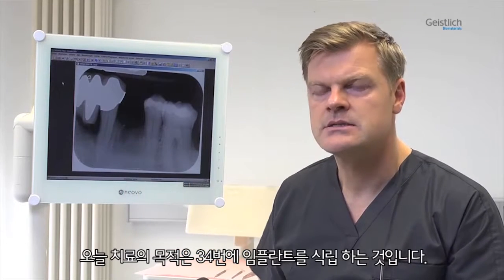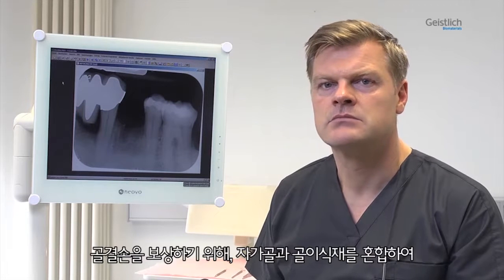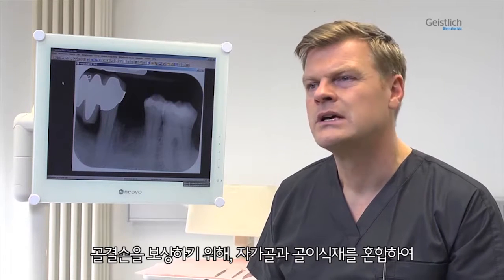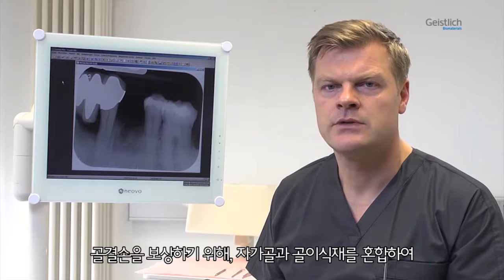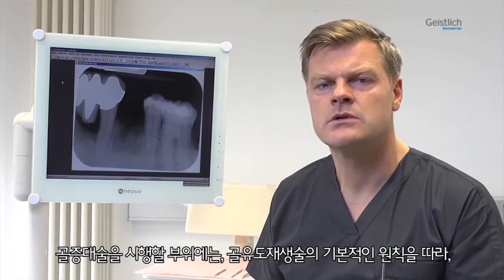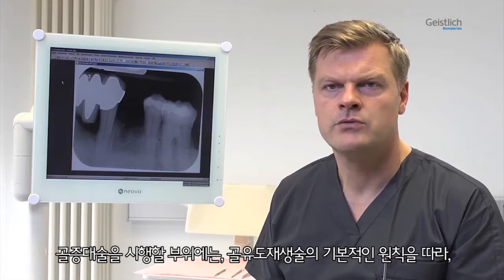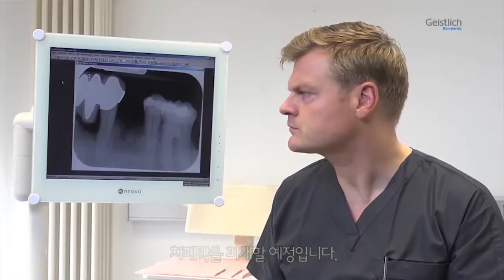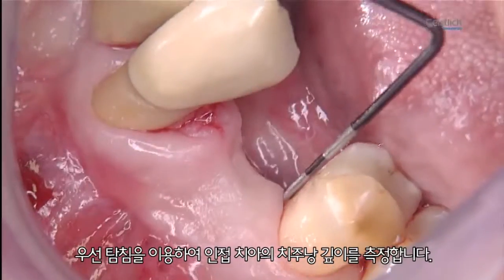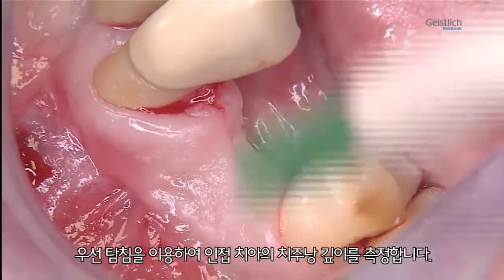At today's appointment, an implant will be placed at site 3-4. To compensate for the ridge defect, we will perform a minor augmentation with autologous bone and bone substitute material. The augmentation site will be covered with a membrane in accordance with the principles of guided bone regeneration. First, we explore the depth of attachment of the adjacent teeth with a periodontal probe.